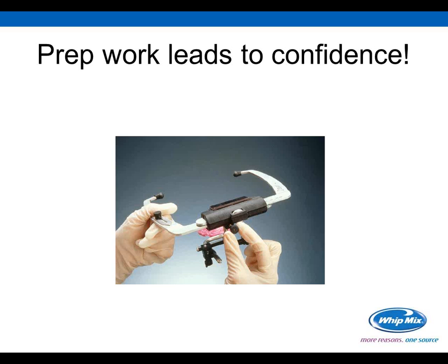This is just a little slide to remind us that it's a great idea to have the Facebow set up before the patient even walks into the room. This way, you can make sure that you have your 21 that you're looking at, your 2 and 1, making sure that you have all the components ready to go when the patient walks in. This really isn't new news to all of us in dentistry because we have setups that we have already prepared for the patient as we walk in. But this is just a quick reminder to help eliminate any fumbling around in getting this portion of the Facebow in correctly.